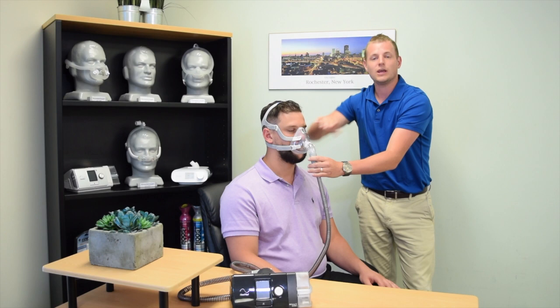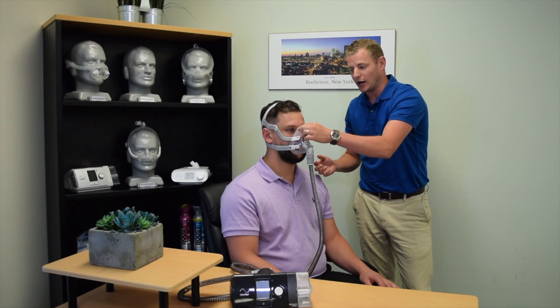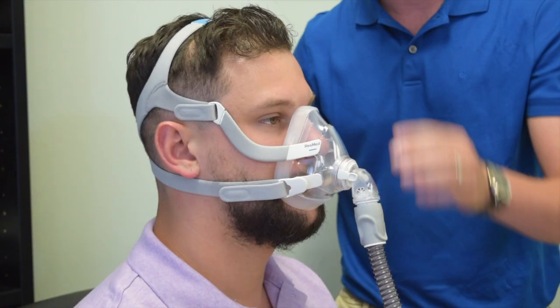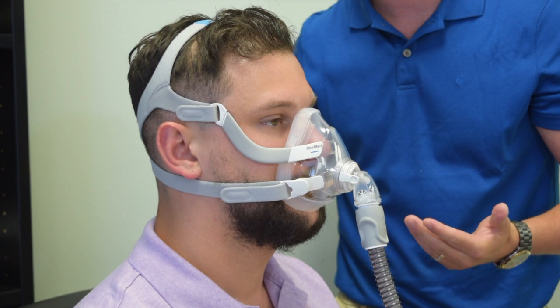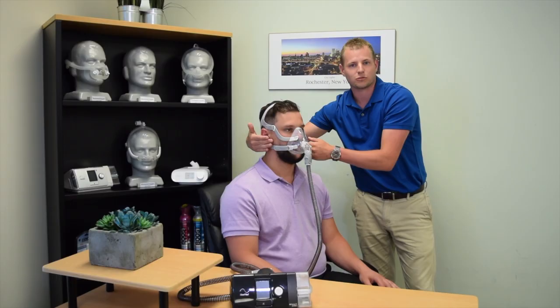When pressure is applied, you may get leakage coming from either the top of the cushion or the bottom of the cushion. The masks come equipped with four velcro adjustable points. If the cushion is leaking on top of the nose, use the velcro adjustments on top of the head. If the leakage is occurring at the bottom of the cushion, use the velcro adjustments on the bottom.